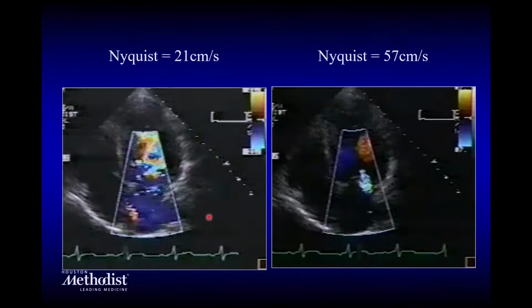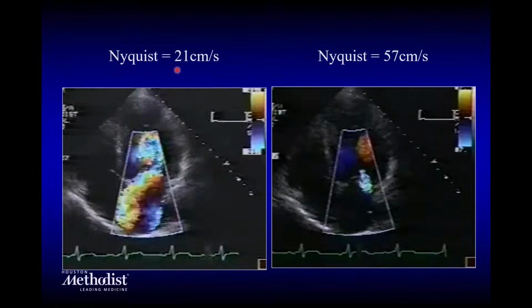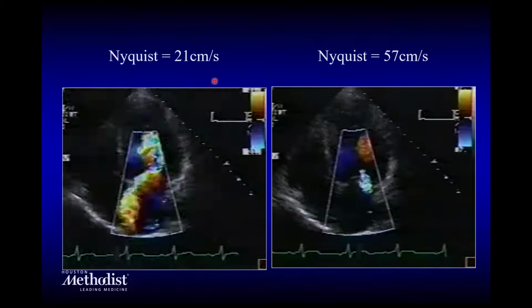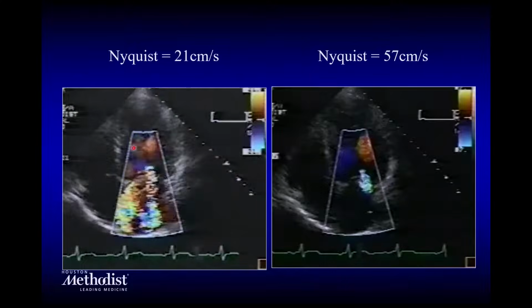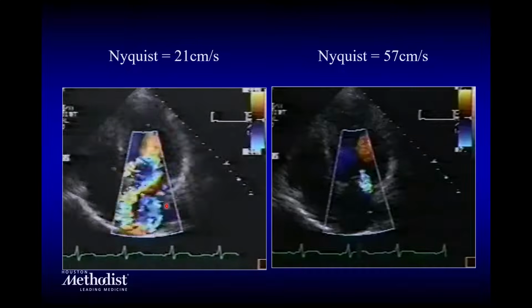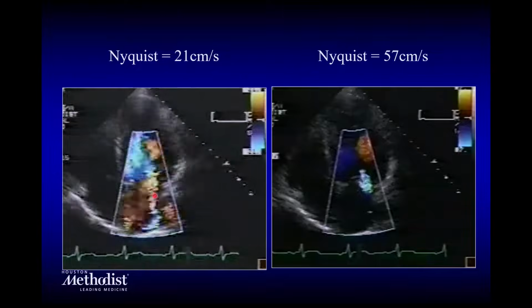Other thing is, if you decrease the Nyquist limit, notice here Nyquist limits of 21 versus 57, and best Nyquist limits is between 50 and 70. So if you decrease the Nyquist limit, you're going to overemphasize the very low velocities of blood flow. So you're going to see not only the regurgitation, but you're going to see any movement that is between 10, 20, and above centimeters per second.